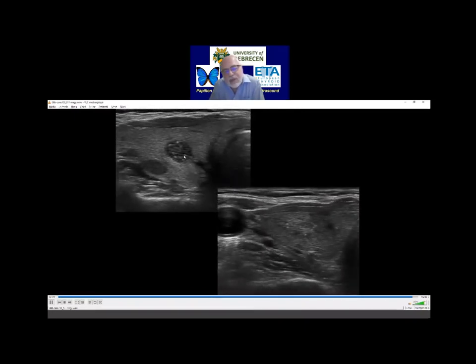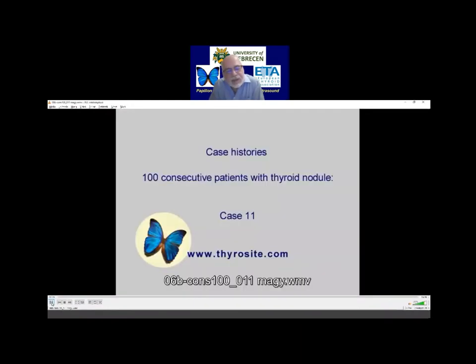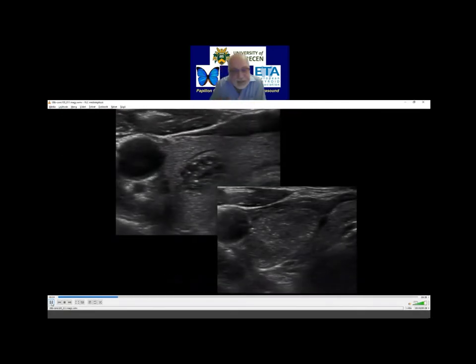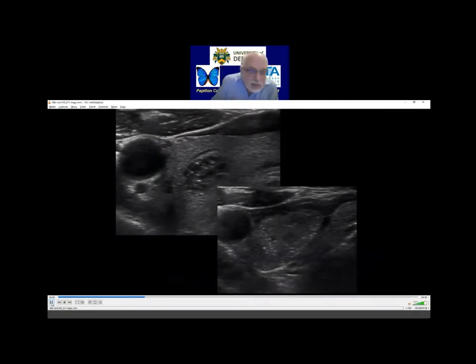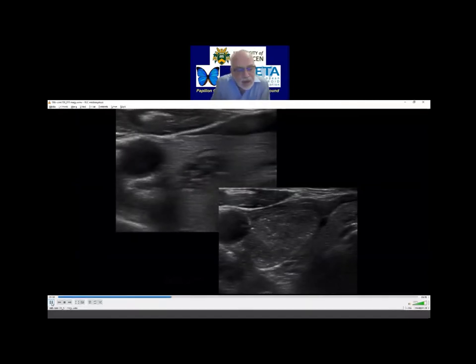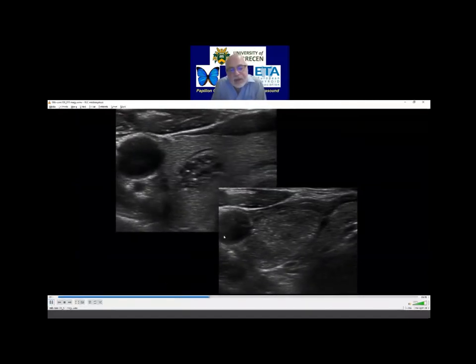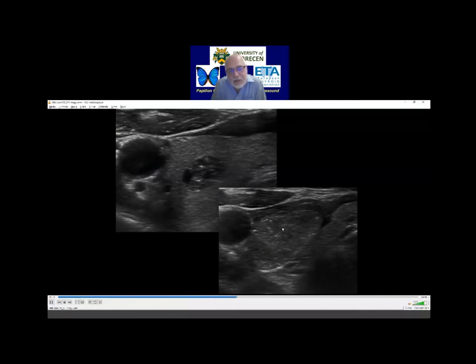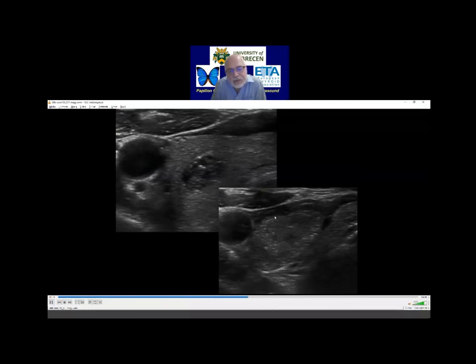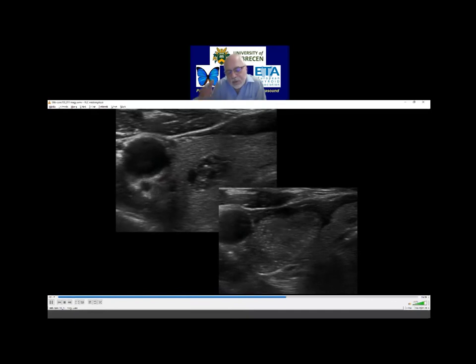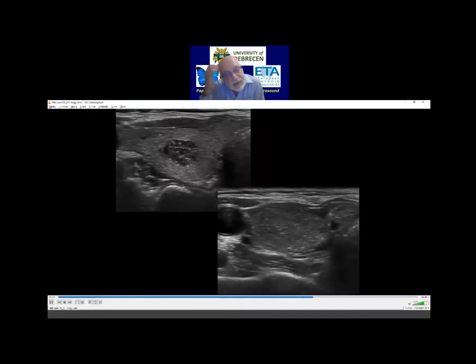Microcalcifications — I think these are not microcalcifications. An experienced investigator has the advantage of examining tens of thousands of patients, but I think it is worth to repeatedly view this video. It will be presented on the website.